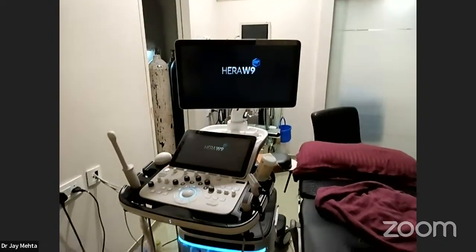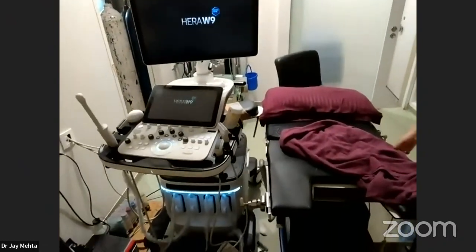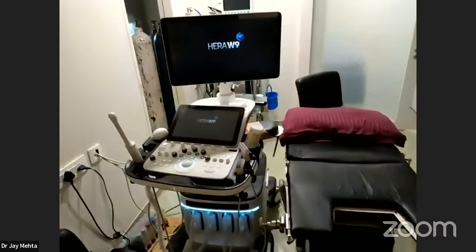I also wanted to show you another absolutely important thing. This is my Hera W9 ultrasound machine, which is just adjacent to the IUI room. An ultrasound is an absolutely essential requirement for anybody to do good IUI practice. You can't really have an IUI practice without an ultrasound machine. So keep that in your head, irrespective of the type of ultrasound machine which you use. You can use whichever ultrasound machine that you want to use, but try to have a good ultrasound machine so that it helps you in optimizing your results better.